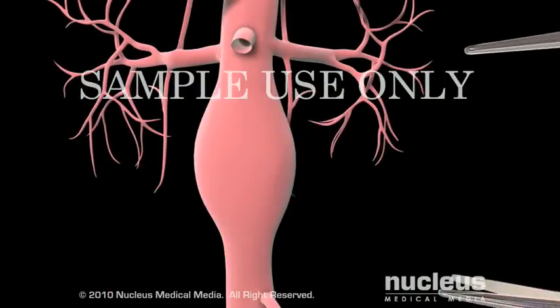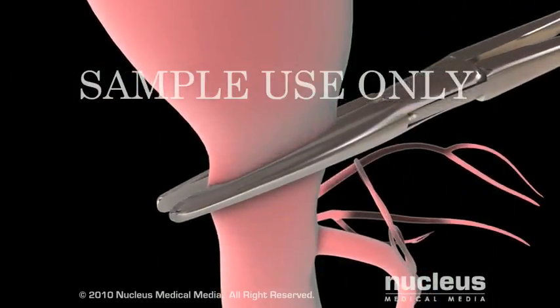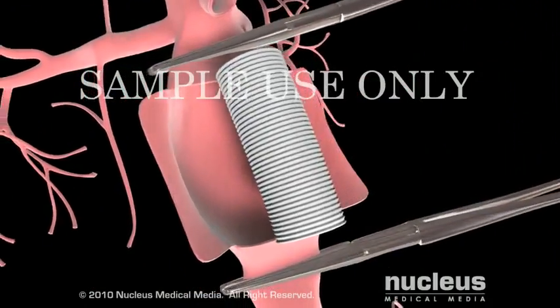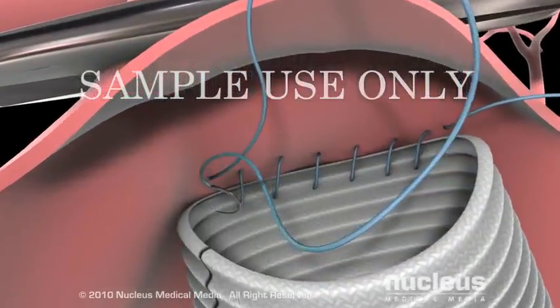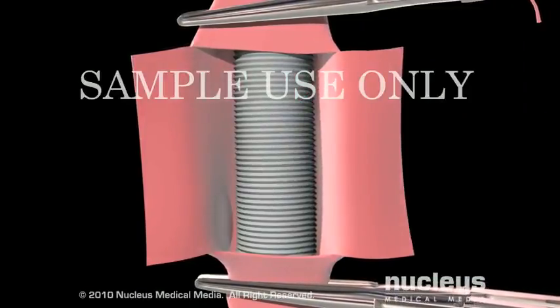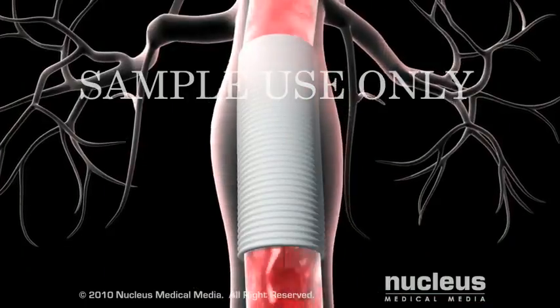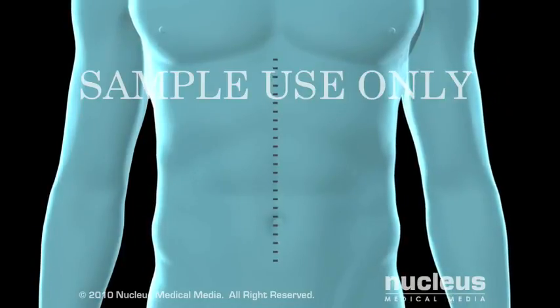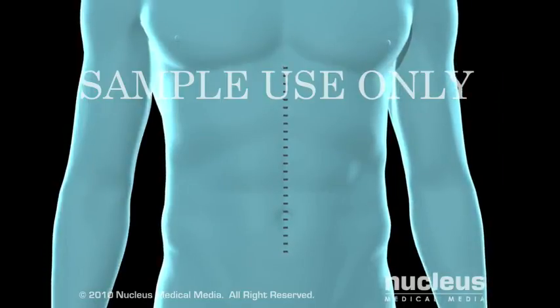He or she will then locate the aneurysm and clamp the aorta just above and below it. Your surgeon will then open the aneurysm and sew an artificial graft, the same size and shape as a healthy aorta, into place. Your surgeon will stitch the wall of the aneurysm closed over the newly placed graft. The graft will reinforce the walls of the aorta. Your surgeon will close the abdominal incision with stitches. The total length of this procedure is usually 4 to 6 hours.